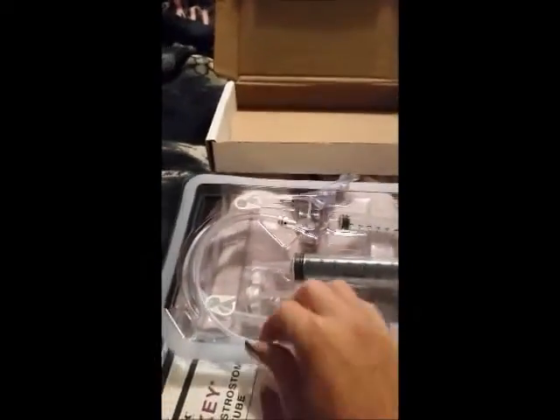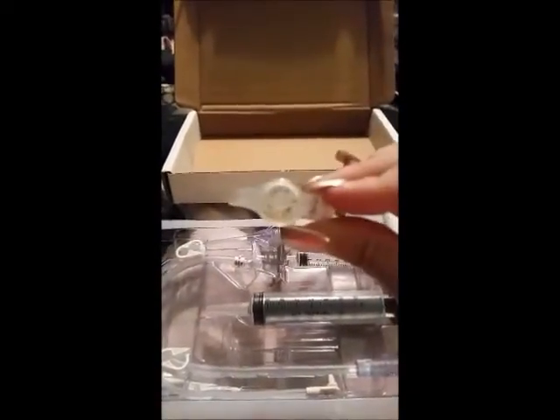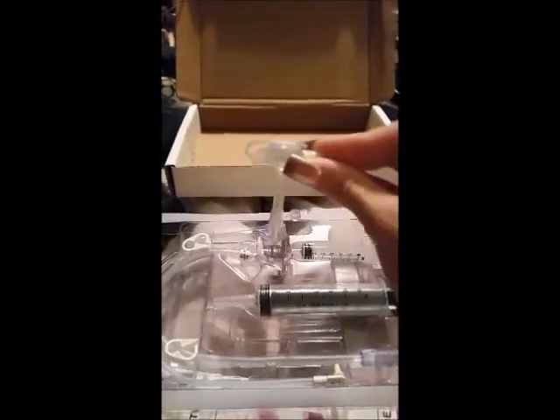And you close this end, and this kind of clips it to keep any fluids from leaking out or in. And if you do bolus feeding, which I'll explain in a second, that's what this extension is for. And then your little button, my little 2 centimeter 14 French button, is right here. This little guy is what gives me supplemental nutrition.